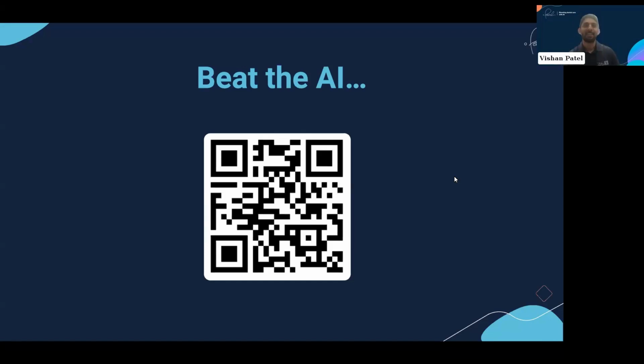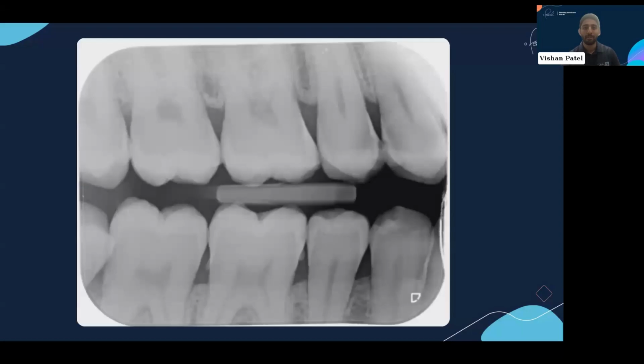All right, so I'm going to now go through a real life scenario which I had on this new patient, so you can see Pearl live in action essentially. On this patient, like normal, I would have charted the teeth, taken intraoral photos, and also taken bitewings. After the X-rays had been developed, I'd normally go over them myself, diagnosing any areas of decay, calculus, bone levels, etc.